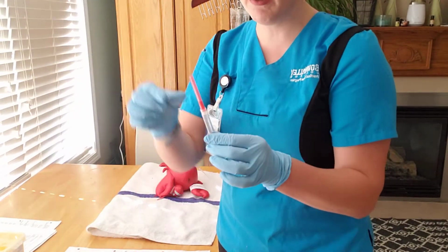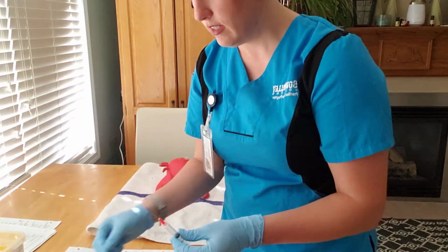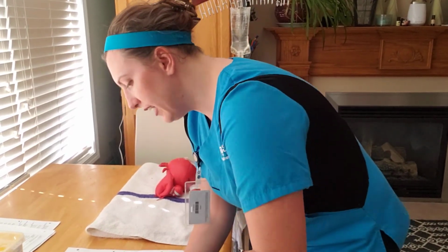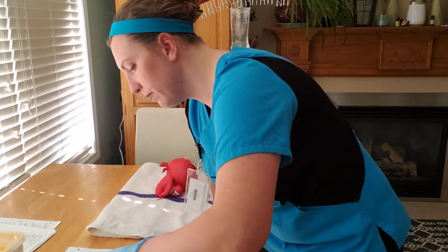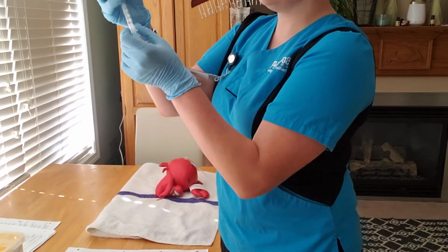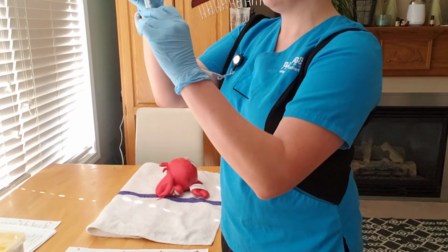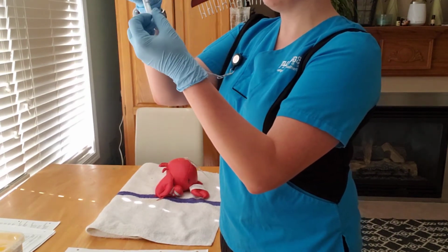So I'm gonna remove the cap to my syringe. I'm gonna inject the 2 mils of air. And now I'm gonna take out 2 mils of my ranitidine. A little air bubble in there.